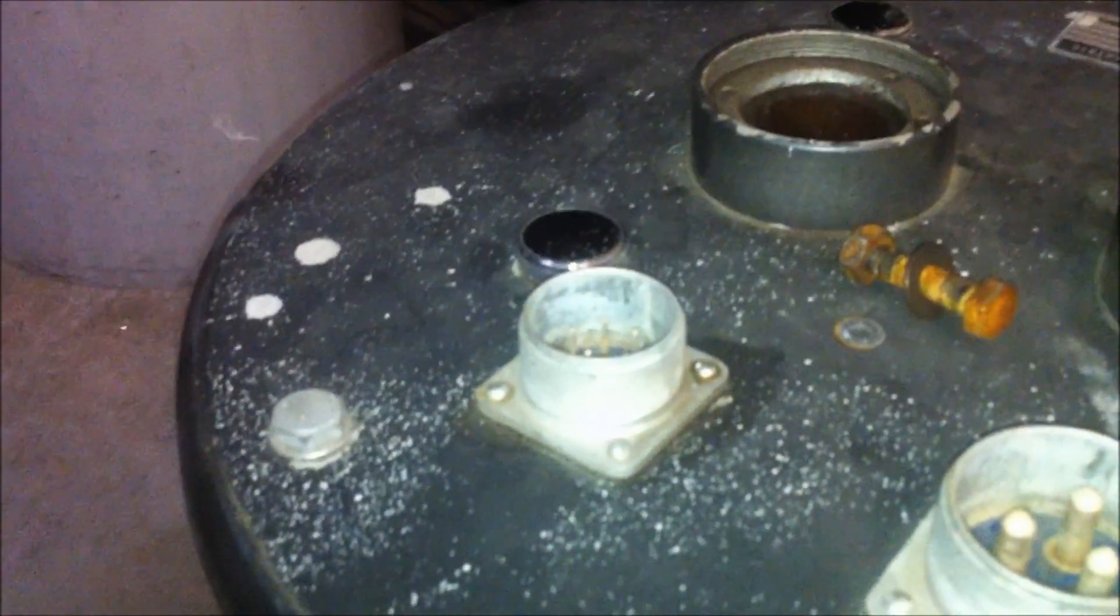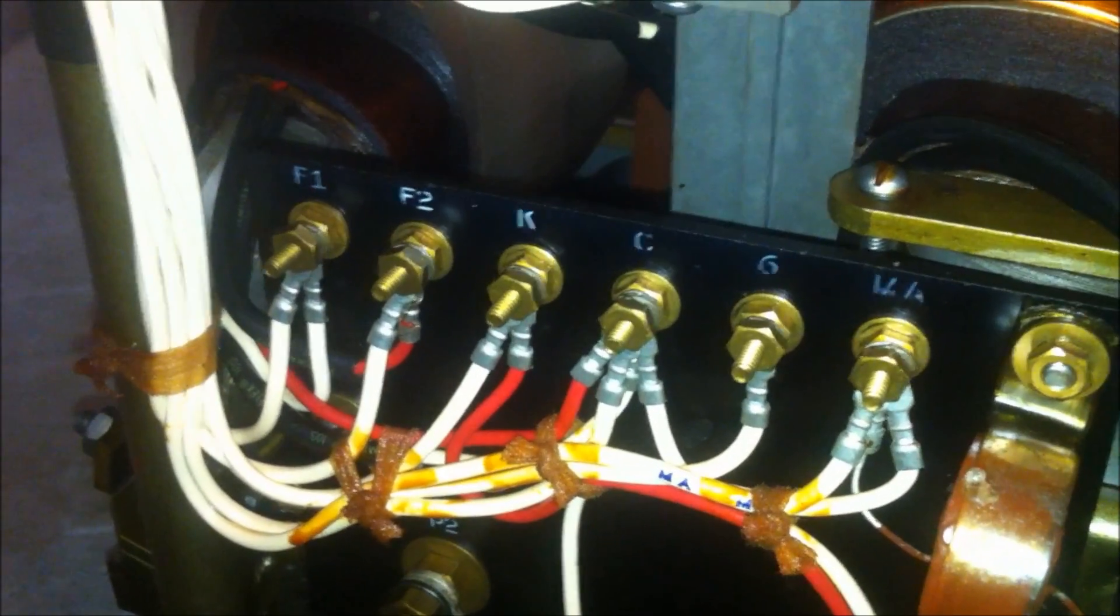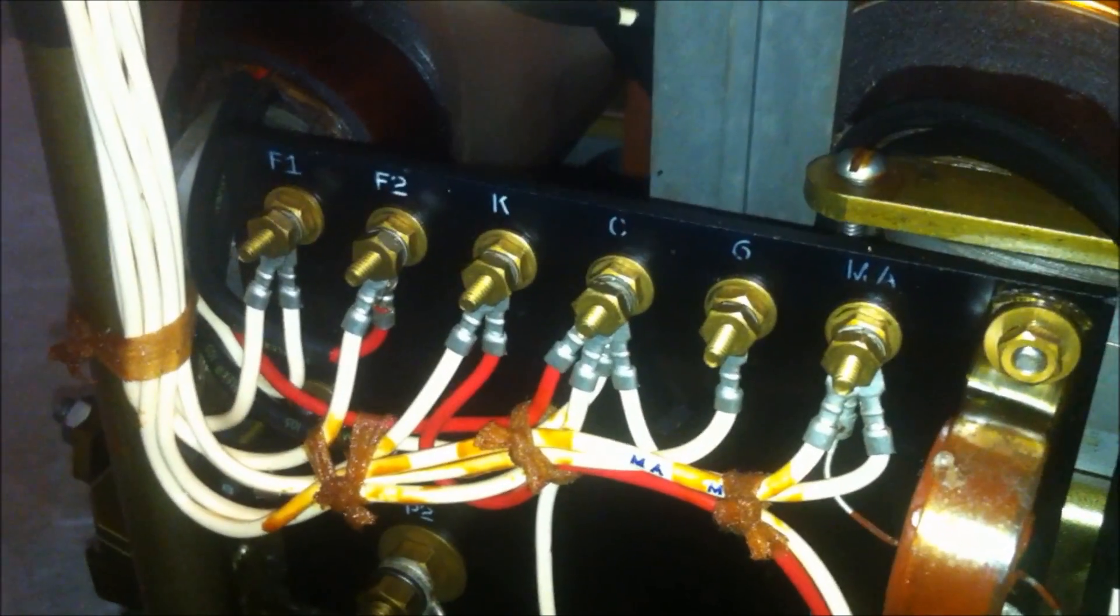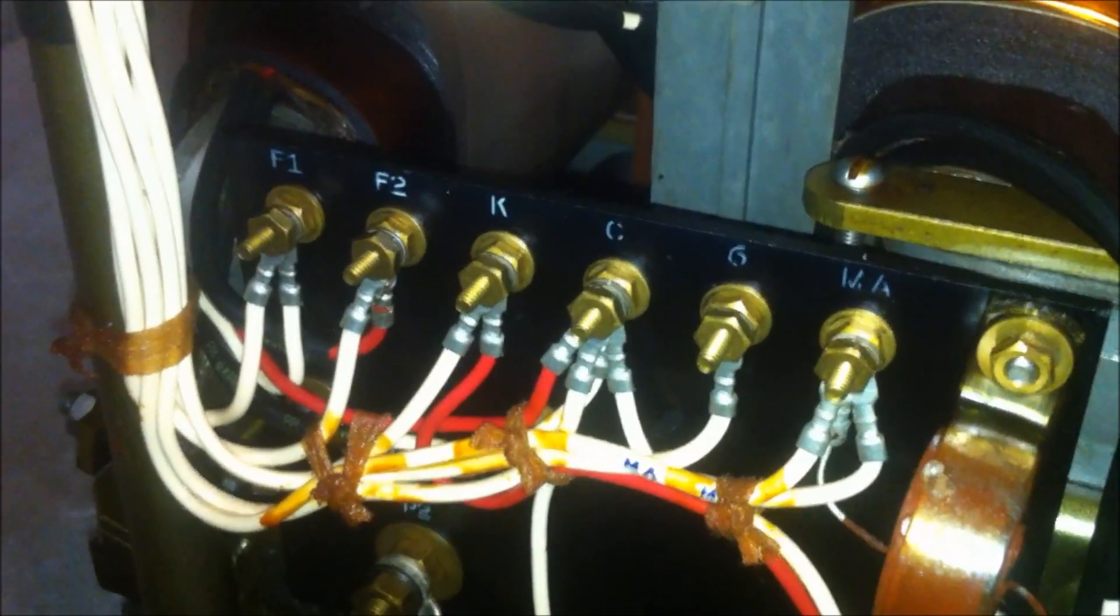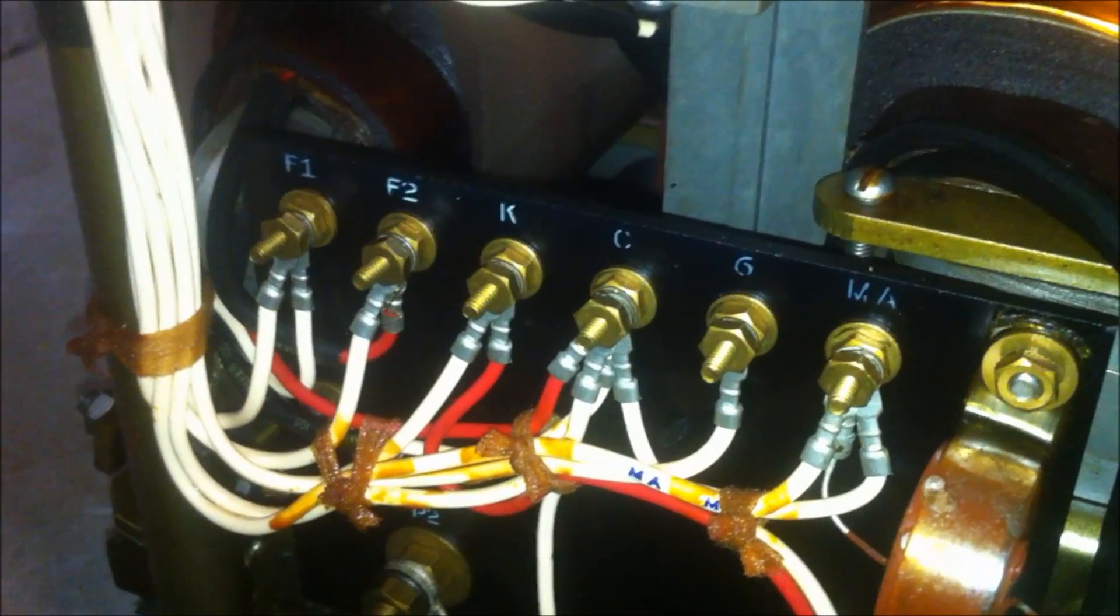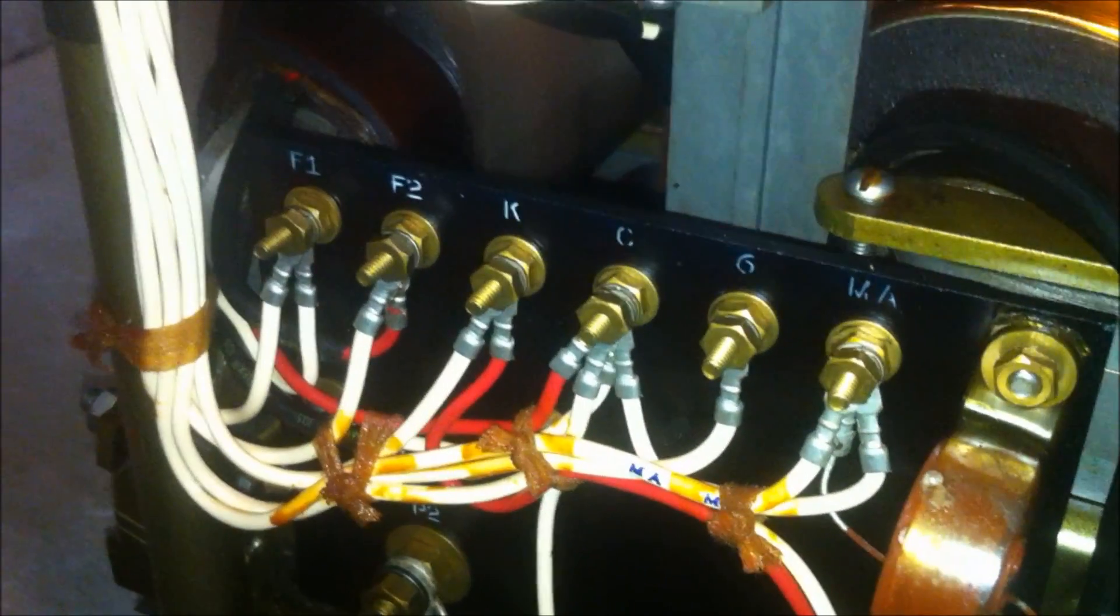You can see that all of them are labeled. We've got F1, F2, K, C6, and MA. I've already tracked a few of those back so I'm pretty confident that they're all for measurement purposes.